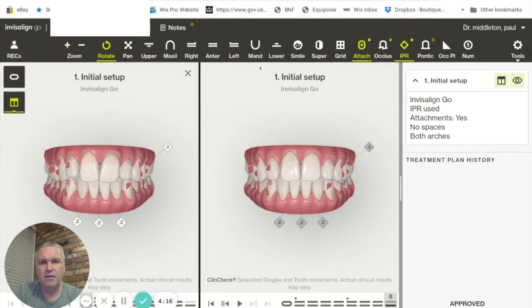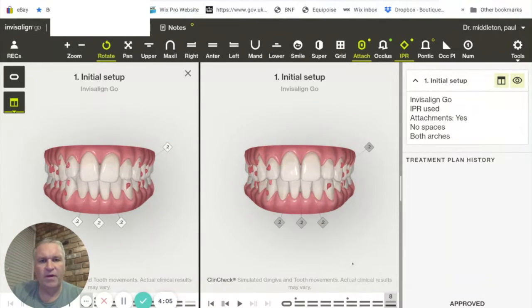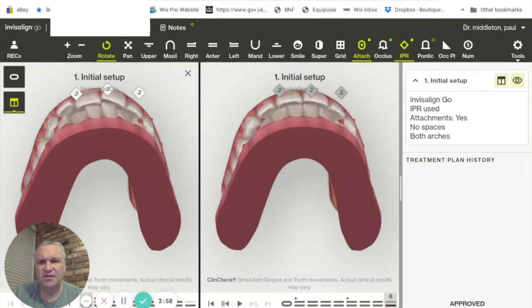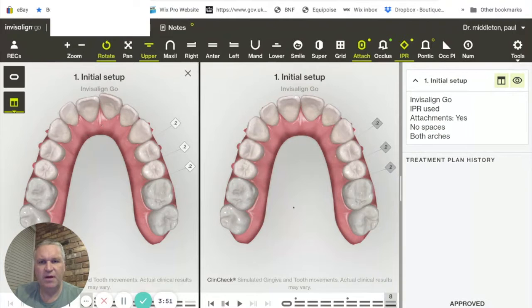You can see on the left here is what we call the initial setup, and on the right here is what we can expect after treatment is complete. This case is at the milder end of things, but you can still see there a difference between the two. There's a little bit of unevenness here, and that's been straightened out on this one.